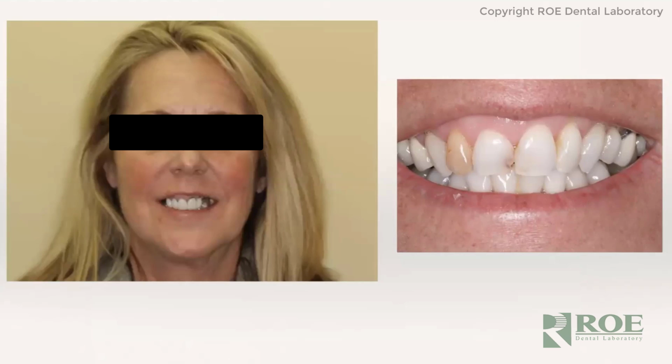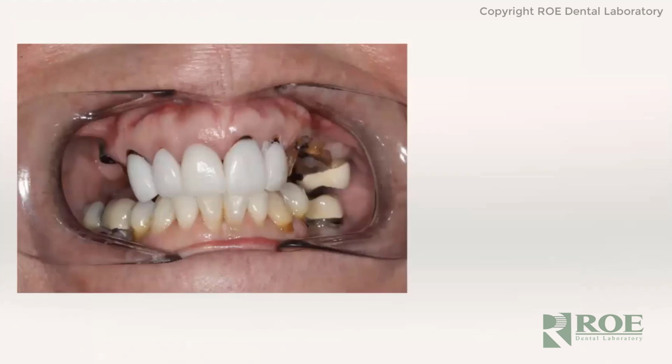This patient came in on the right-hand side. This is her smile from 12 years ago, and we didn't see her for about 12 years, and she didn't take care of herself. We can see that she has a higher lip line and a gummy smile. How is this going to change what we do for her? And where the transition line is, how much bone are we going to have reduced? Or in a case like this, is this a wonderful case for an FP1 and maybe that chrome natural?